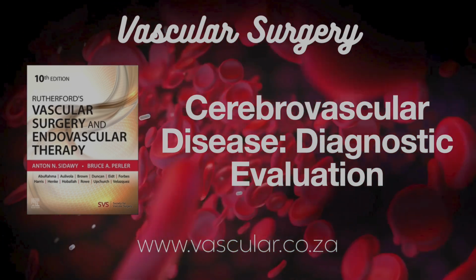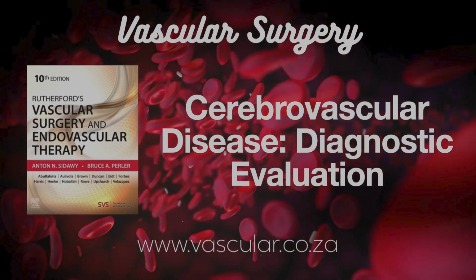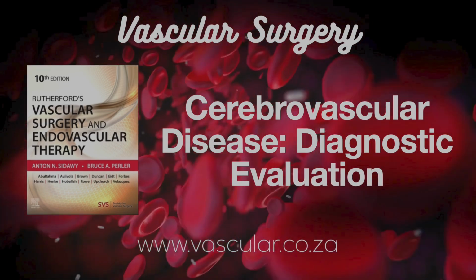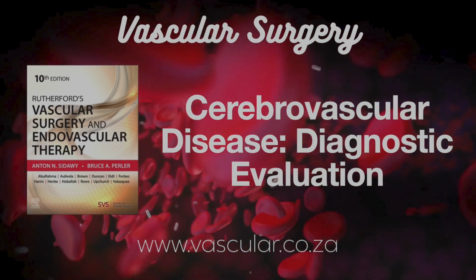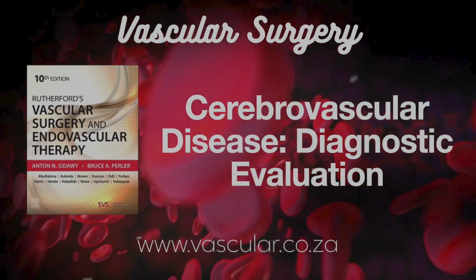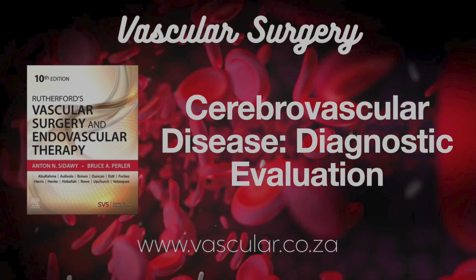Essentially, yes. DSA could provide it too, but CTA is less invasive and usually the first choice unless there's a strong contraindication like severe kidney disease, or it's an emergency where you might go straight from diagnostic DSA to the treatment. Got it. What about TCAR, the transcarotid approach? What's critical on the CTA for that?